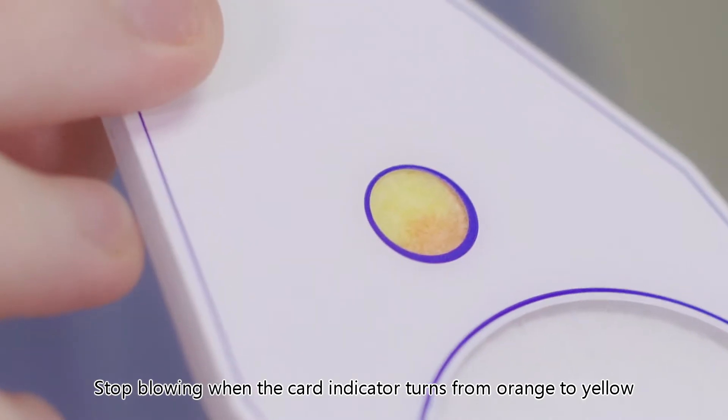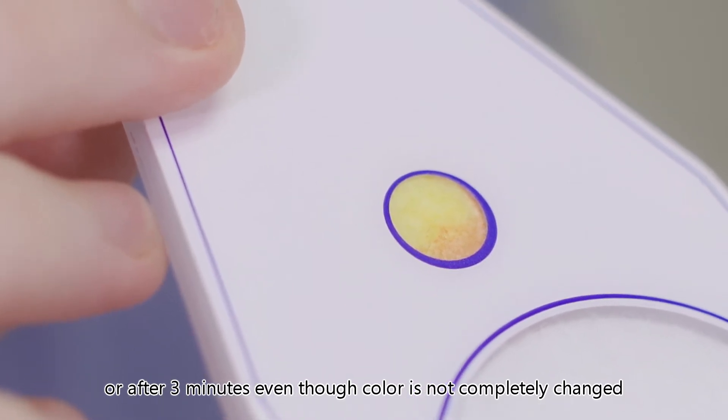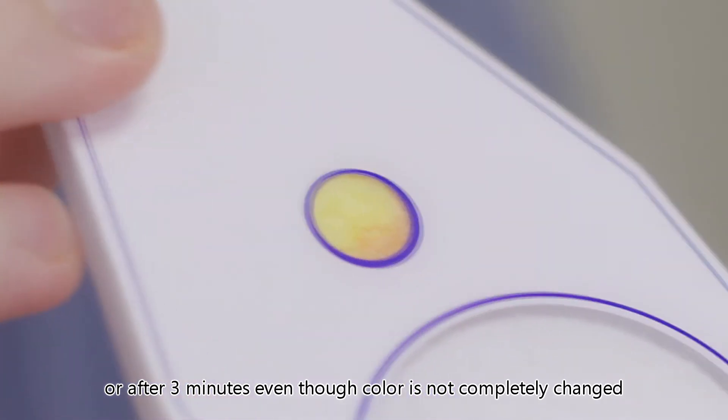Stop blowing when the card indicator turns from orange to yellow, or after three minutes even if the color has not completely changed.